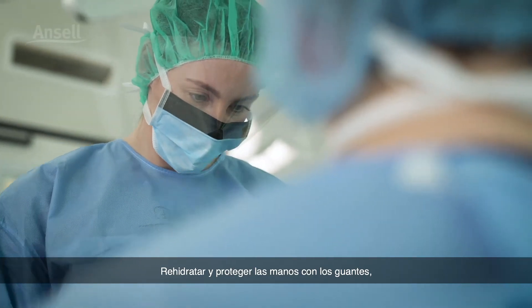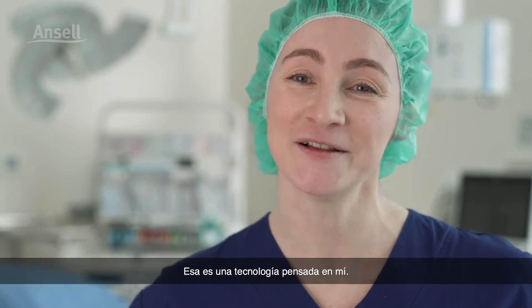Rehydrating and protecting my hands while gloved — now that's technology that works for me.